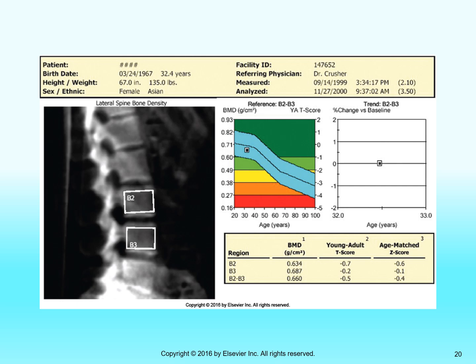Even if you've not been trained in bone densitometry, you can figure out what they're trying to show you by looking at the chart, and that's giving you more information than the x-ray is actually giving you. So the x-ray is only showing you where the measurements were made, so to speak. Okay.